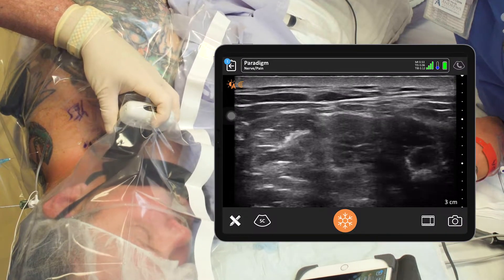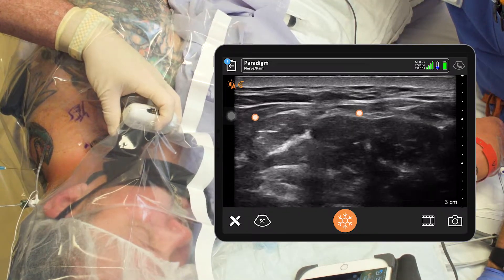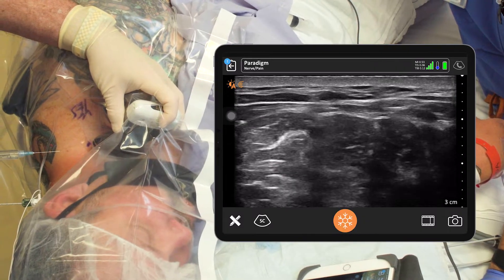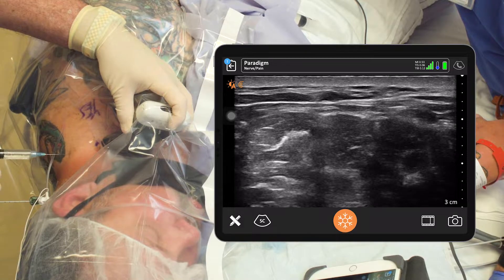So it's tough to see. You've got some nerves right in there between the anterior and middle scalene muscles — you can see those better than anything — but this is where we want to go. A numbing shot here on three: one, two, three.